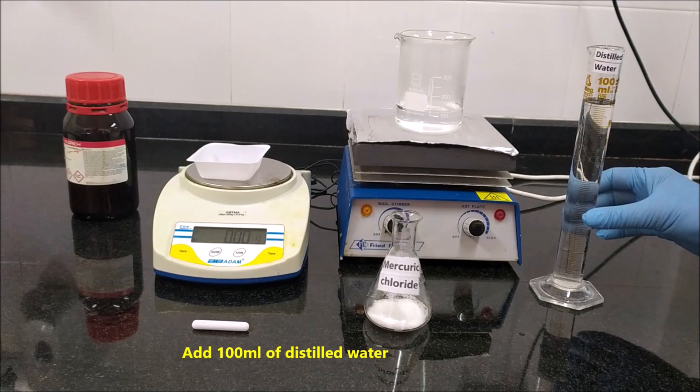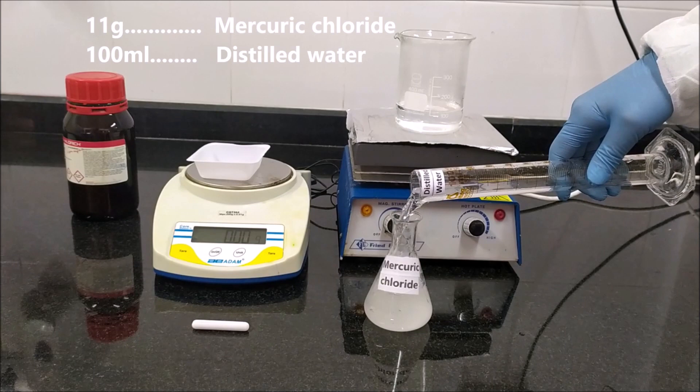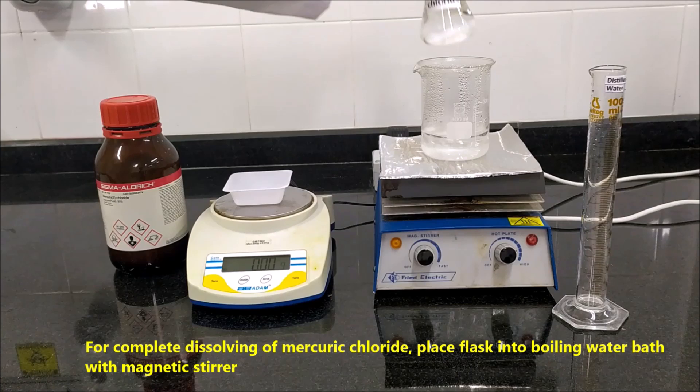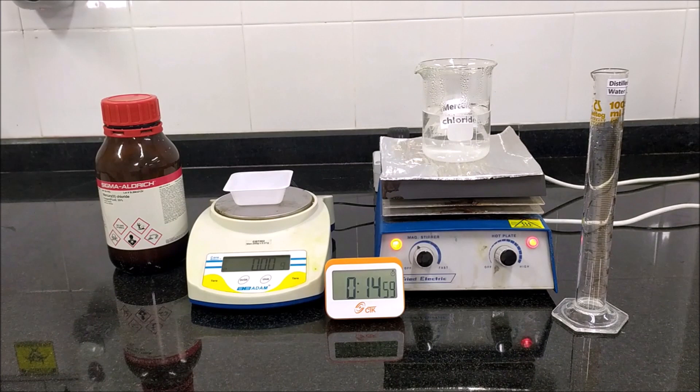Add 100 ml of distilled water. For complete dissolving of mercury chloride, place the flask into a boiling water bath with a magnetic stirrer. Boil until the mercury chloride has completely dissolved. Usually 15 minutes are sufficient.